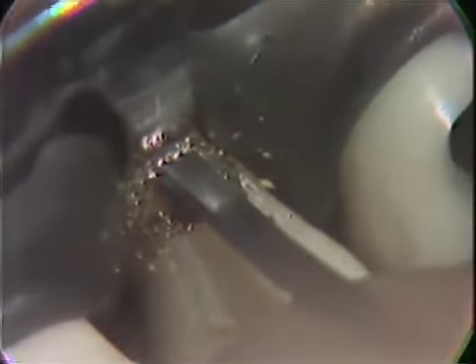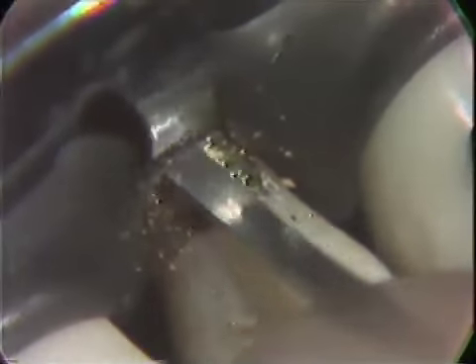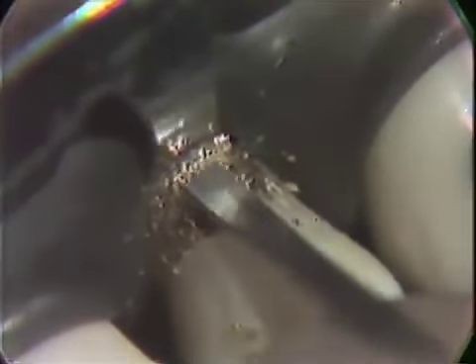Now, this fits better into that area, and it's used with a push motion, just picking up a small amount of the surface of the metal, carrying that down to get rid of that small excess material at that point, and you see exposing then the cervical margin.